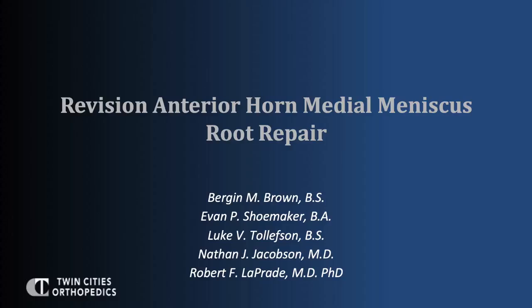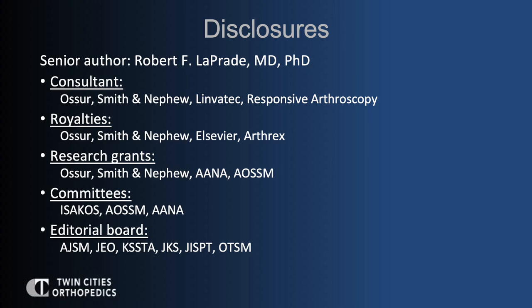This is a video presentation of a revision anterior horn medial meniscus root repair. The disclosures for the senior author are listed.